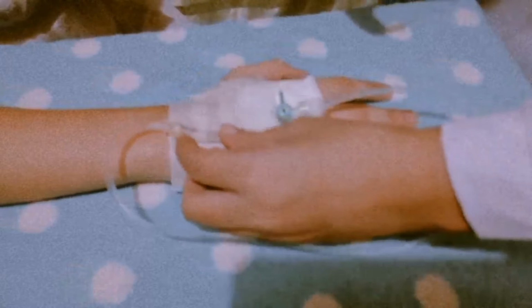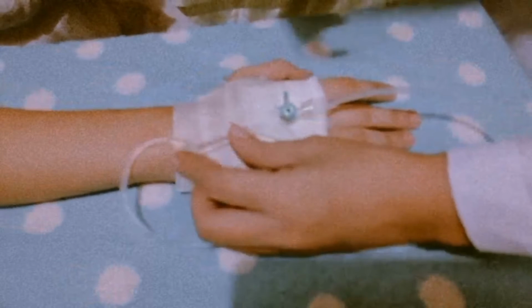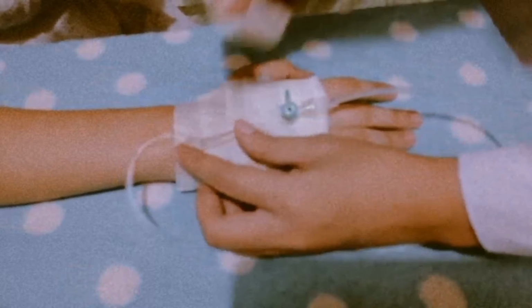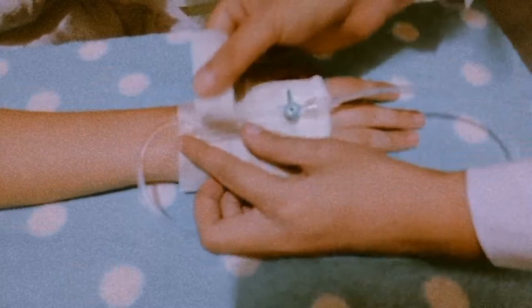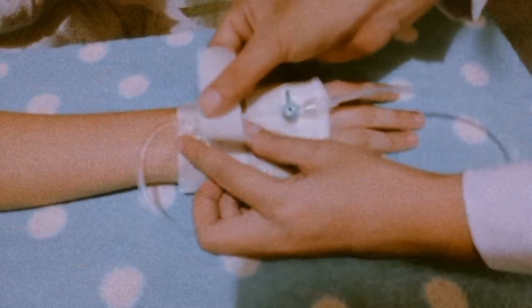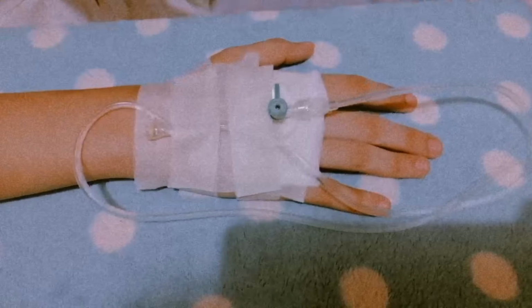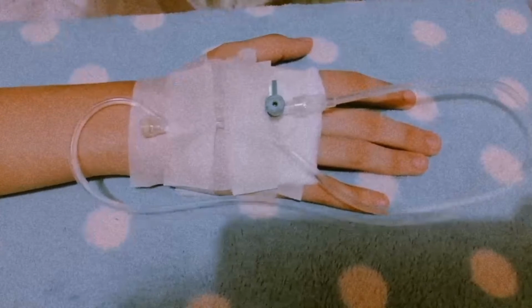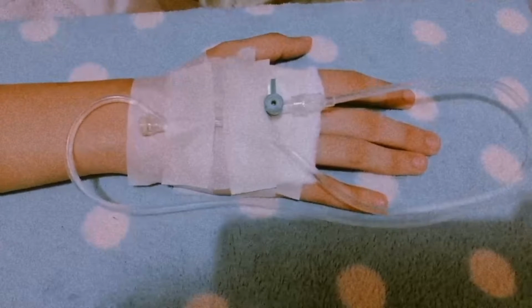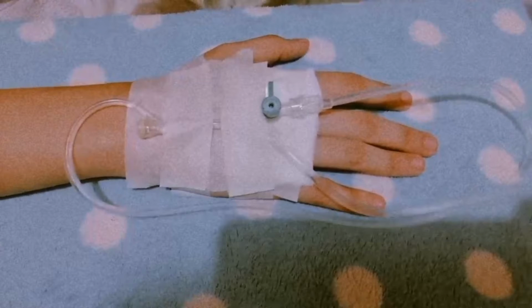The smooth structure of the vein does not offer resistance to the movement of the needle. The weight of the tubing is sufficient to pull the needle out of the vein if it is not well anchored. Anchor the arm to an arm board for support if necessary. An arm board protects against change in the position of the vein and acts as a reminder to the client to minimize arm movements.